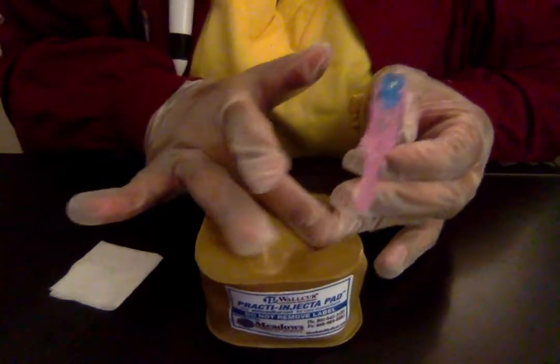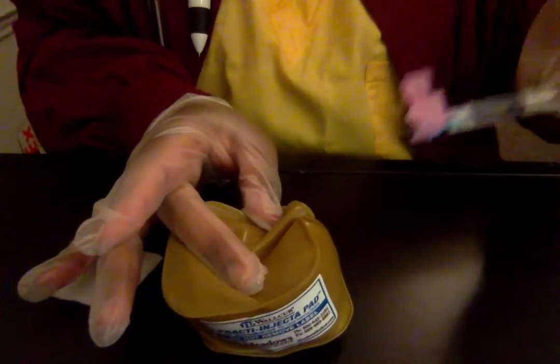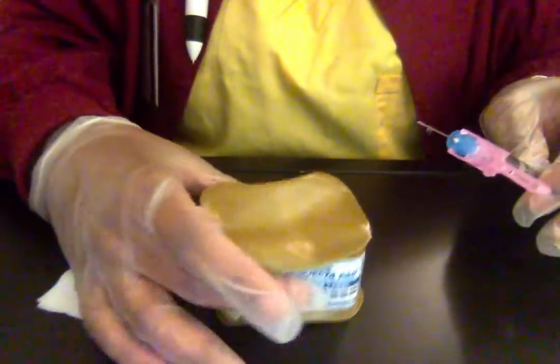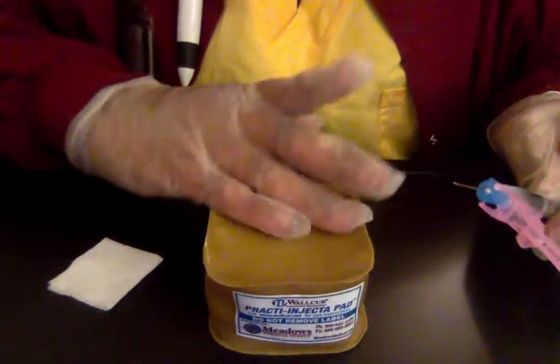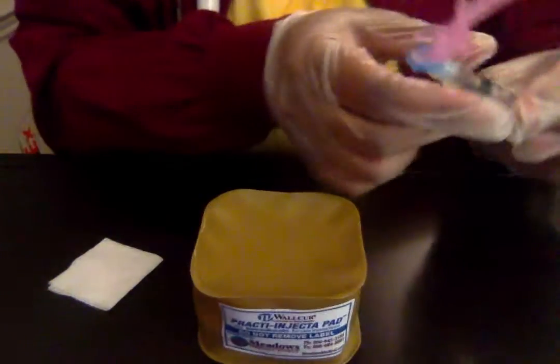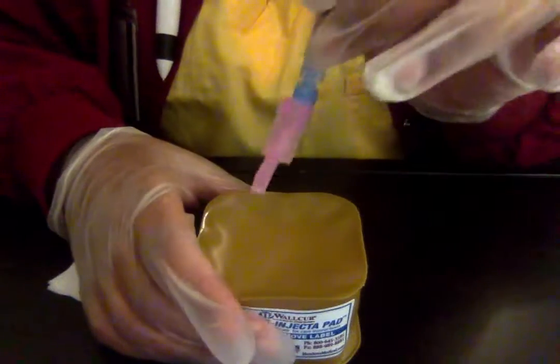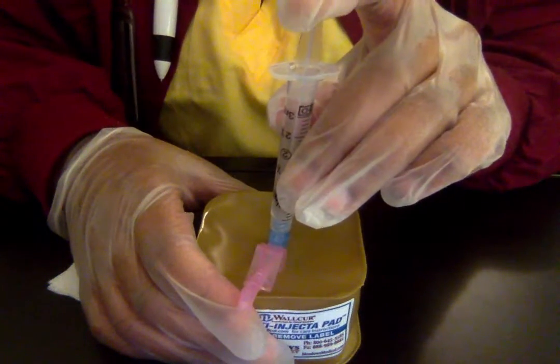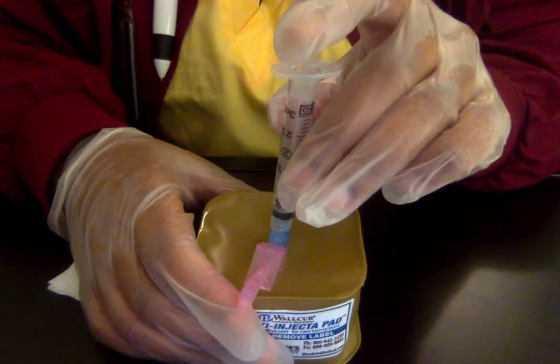But in a normal Z-track, I would move to the side and then insert over here because I'm moving that fat out of the way. So we're going to pretend like I'm Z-tracking right now, moving that skin out, and then I would go in at a 90-degree angle, and then I would go ahead and slowly but quickly insert it.